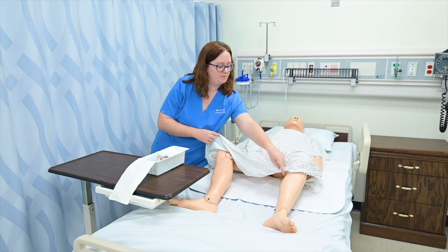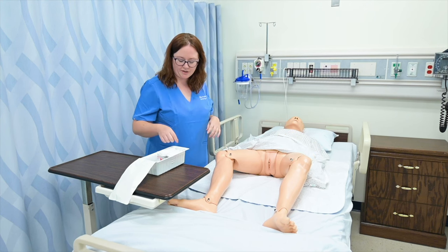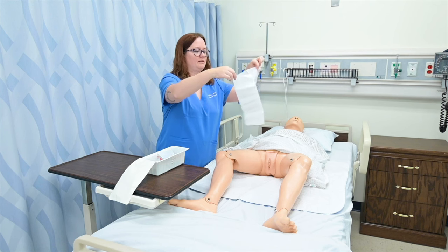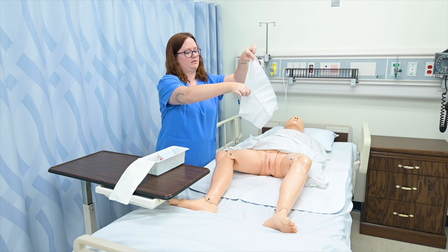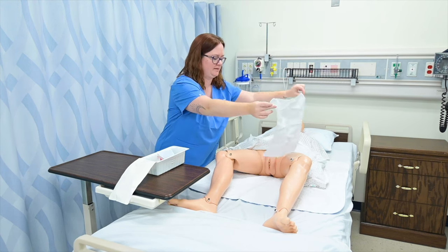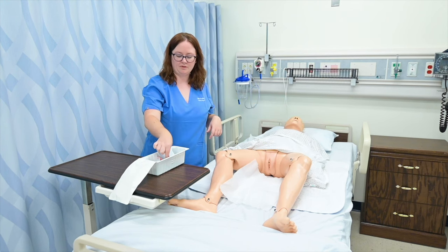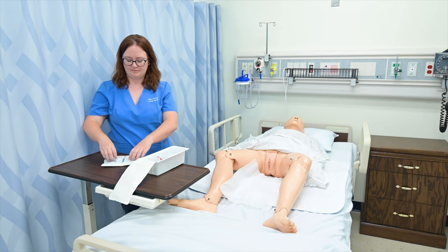I'm going to pull my patient's gown up to expose her urethra. I can take this initial pad and place it shiny side down, taking care not to touch too much of it. All right, I'm gonna take these gloves out, go ahead and put my sterile gloves on.